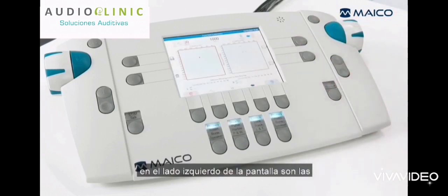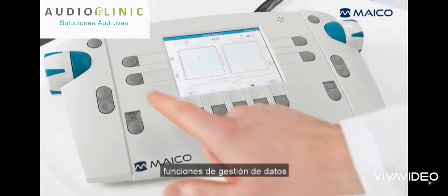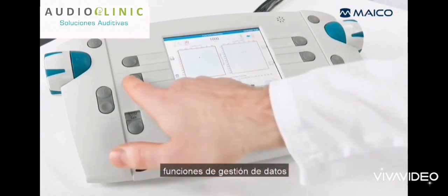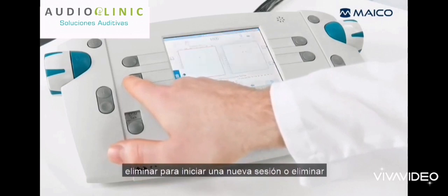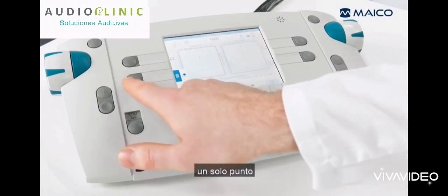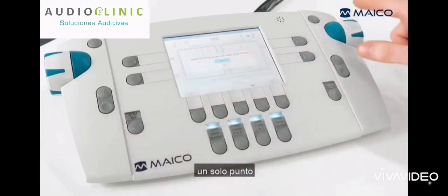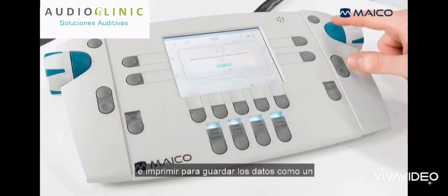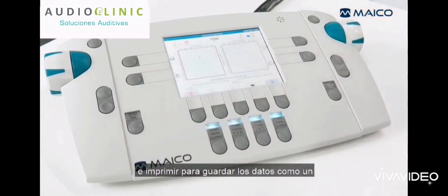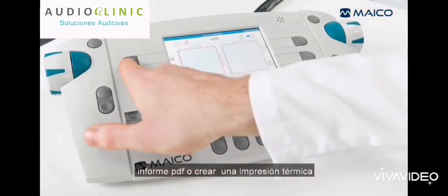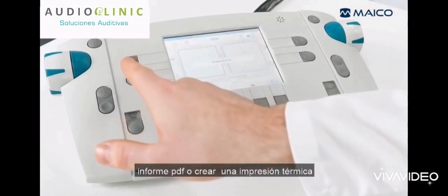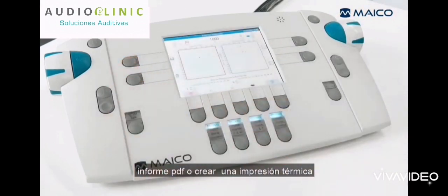On the left side of the screen are the data management functions. Delete, to start a new session or delete a single point. And print, to save the data as a PDF report or create a thermal printout.